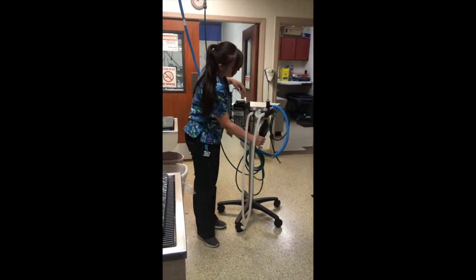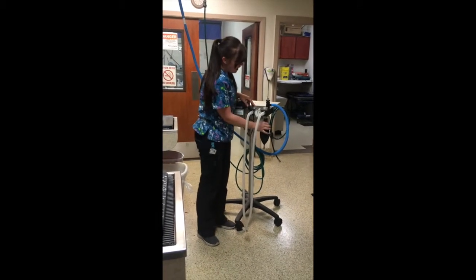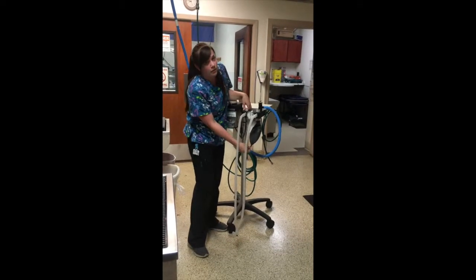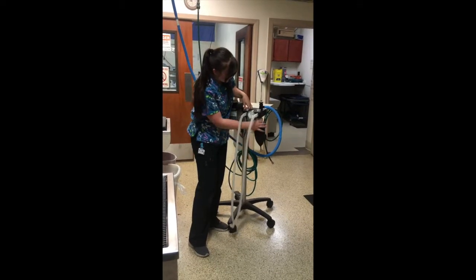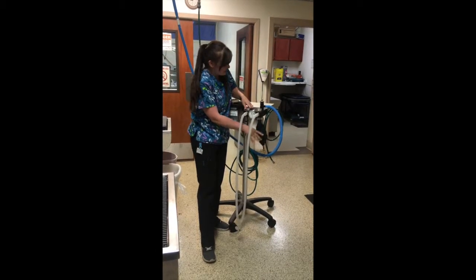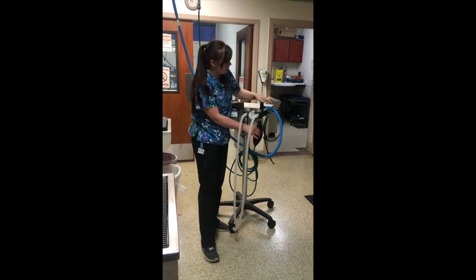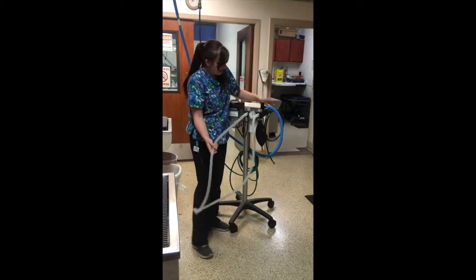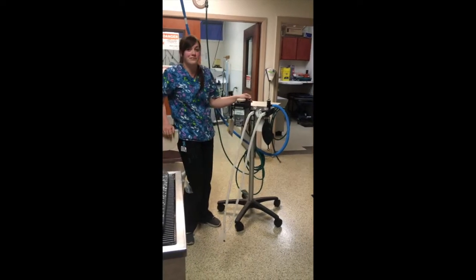There's also the reservoir bag, and this fills with the gases that come from the vaporizer, the oxygen, and the vaporized anesthetic agent. So when the vaporizer fills, you want to choose the appropriate bag for the appropriate size dog. If you need to give a breath to the patient, you can hold your pop-off valve closed, give a breath to the patient, and let it go. And that is our rebreathing system.